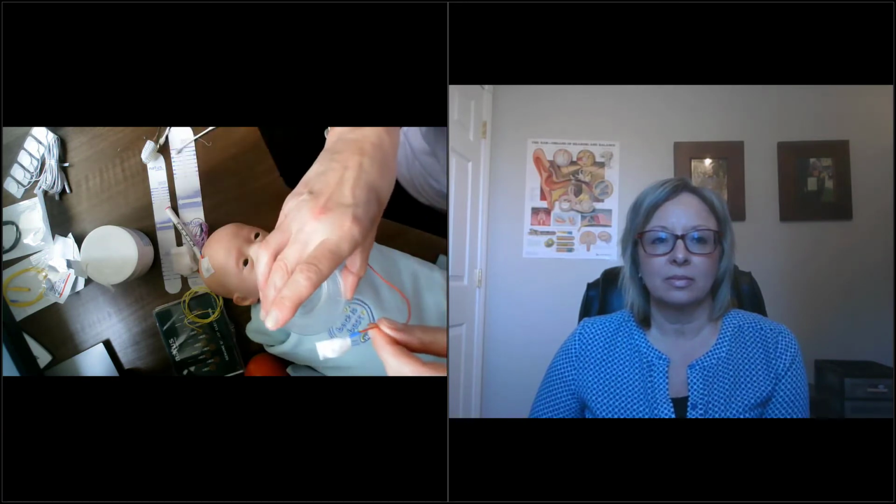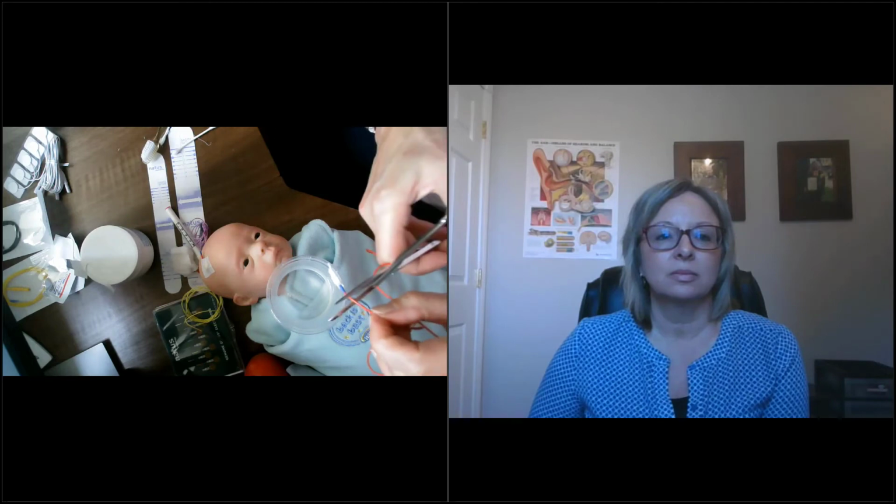Then I take the whole electrode and remove it. Another option some people use is to have a small pot and a pair of scissors, once you have disconnected from the data acquisition box and unplugged them. I know some people who will cut the end off into a pot, and that should remove any potential for needle stick injuries, if that helps.